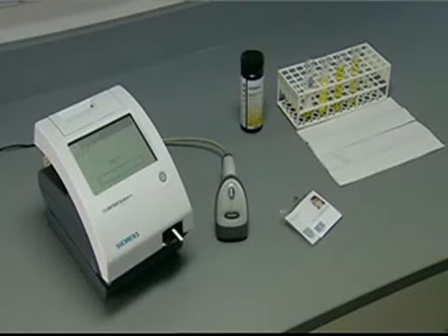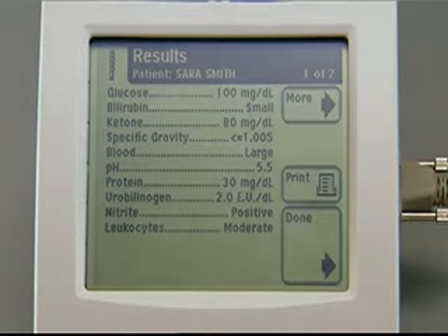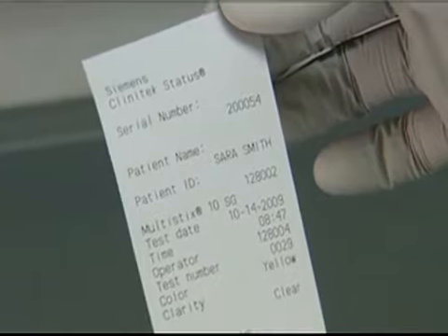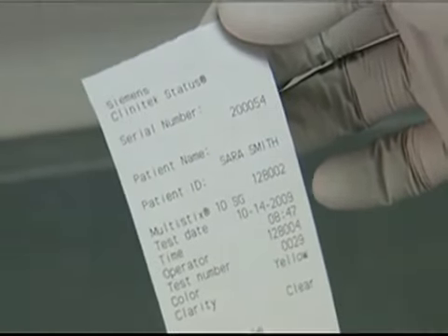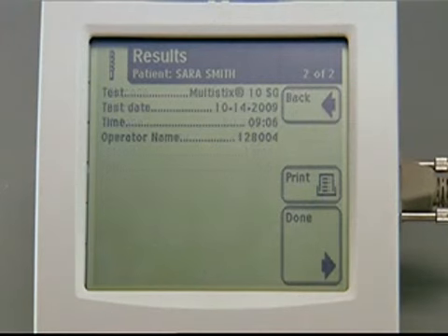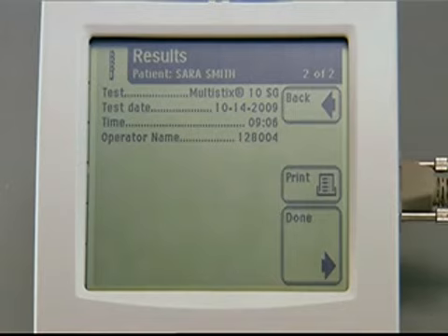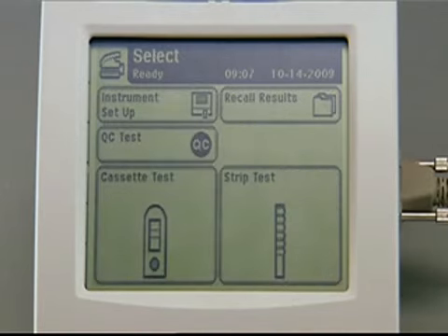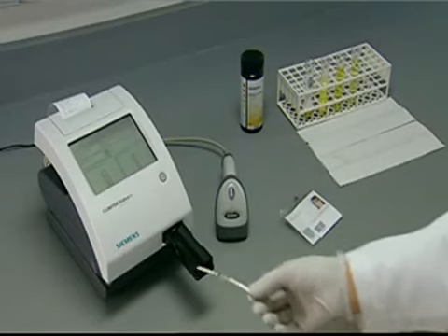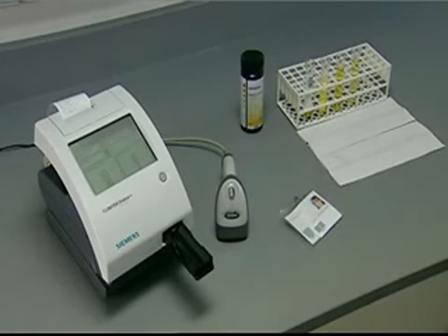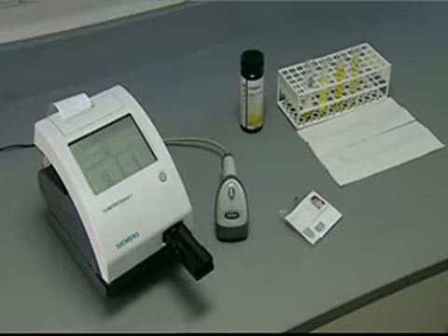Once analysis is completed, the test strip is ejected and the results can be viewed on screen or on a printout. The color and clarity information will be included on the printout. On the results screen, press the More button to view the additional time, date, operator, and patient information that is now available. Press Back to return to the main results screen, then touch Done to complete the test and return to the main select screen. Remove the used test strip and dispose of it, reporting results according to the procedures specified at your facility.